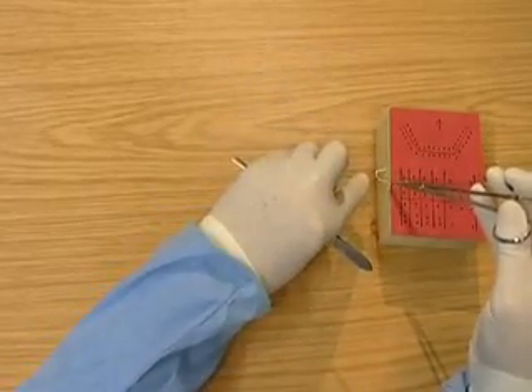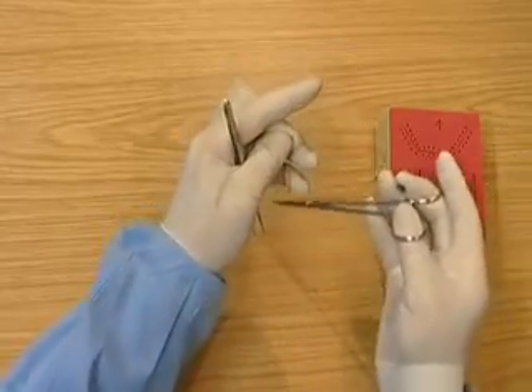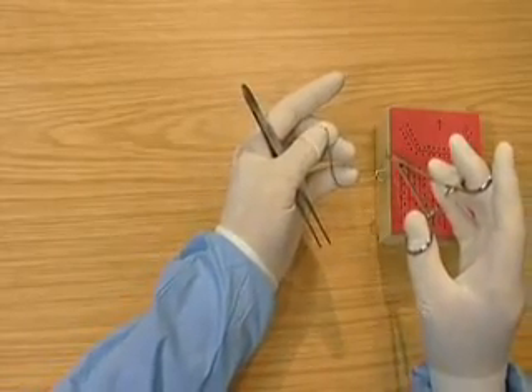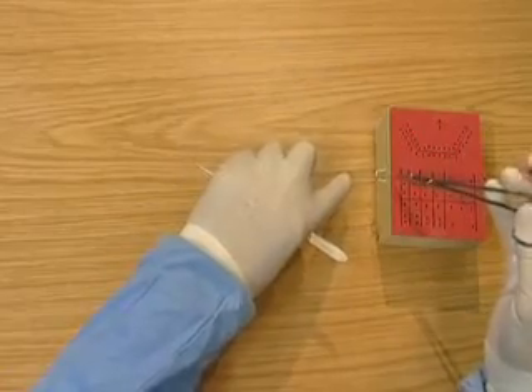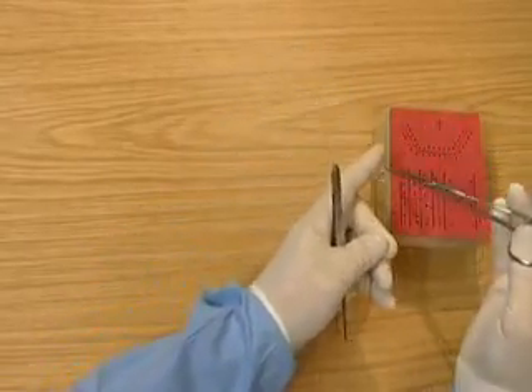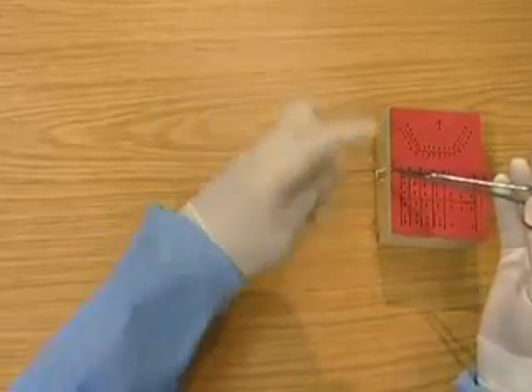Using the first finger to tie the knot and unwinding — going under just once, pulling through and tightening the knot, then going over once, pulling through and tightening the knot.